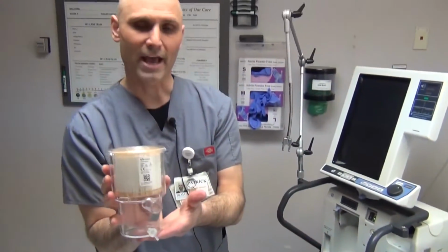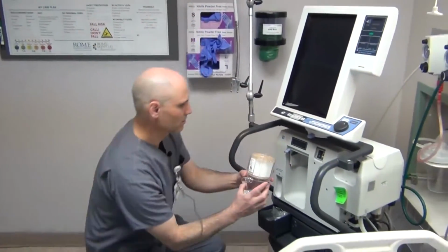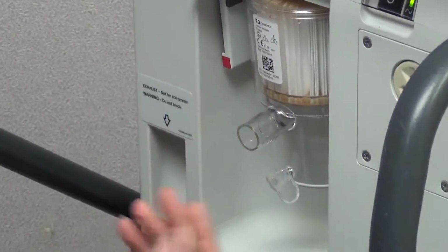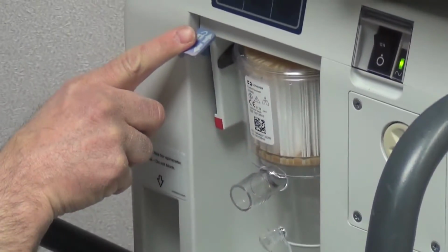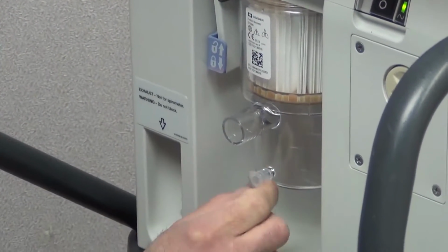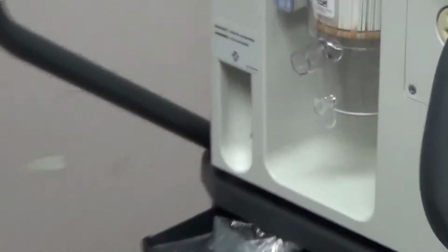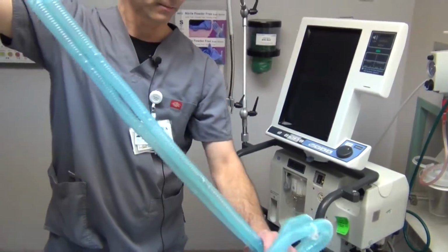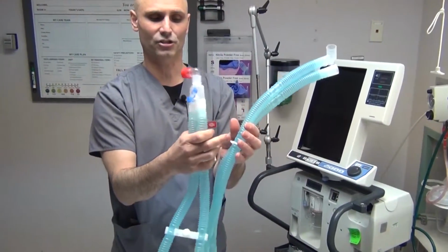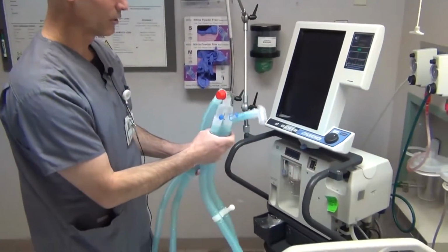So first of all, you have an exhalation filter, which will be installed right here. You slowly insert it, facing forward with the tubing, and push this blue lever down. You want to make sure that this port is covered with this little rubber cap. You're going to take your circuit, which could be in a bag, and it sometimes has a clear tubing attached. The clear tubing is not necessary. You would just have this blue tubing.